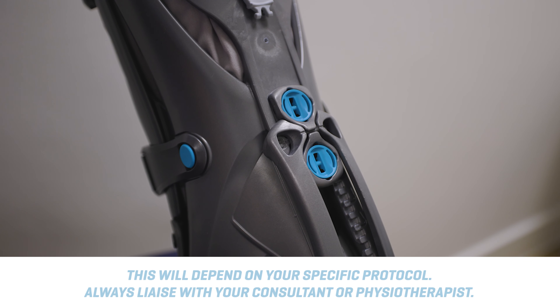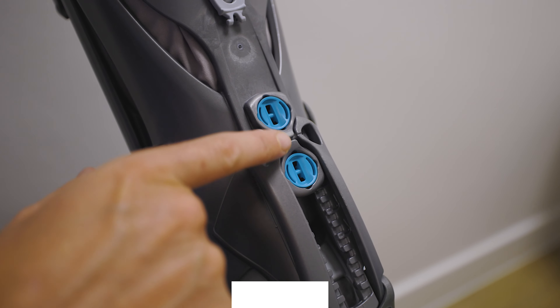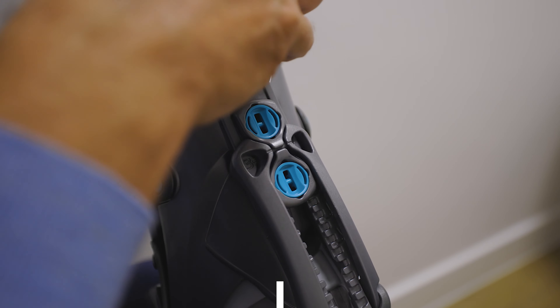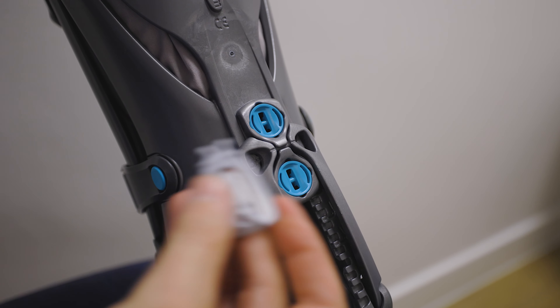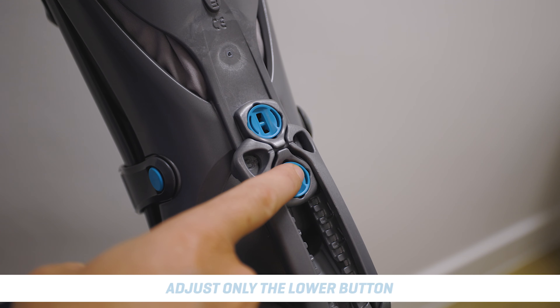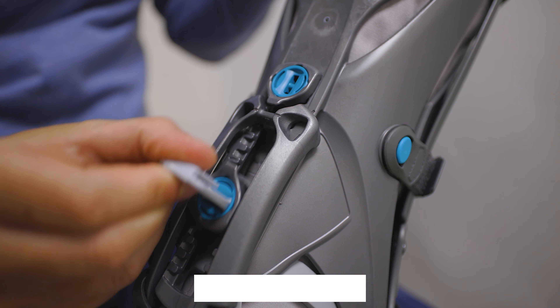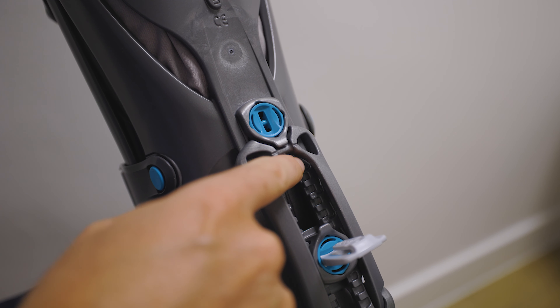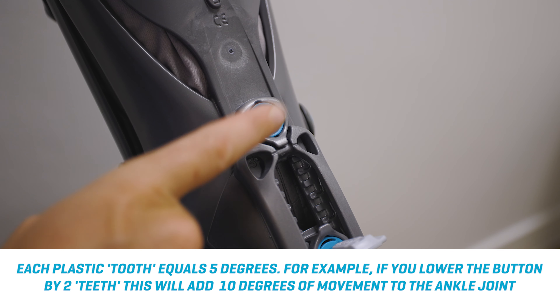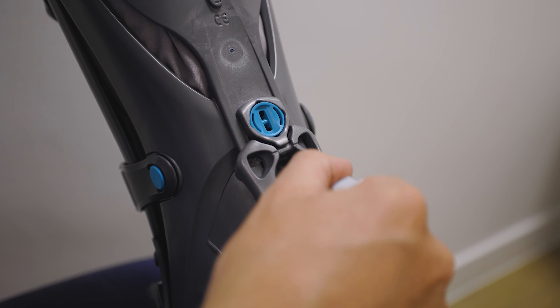After around four weeks, it's normal for your consultant or physiotherapist to ask you to change the angle of your foot. At the moment it's at 30 degrees — you can see there'll be a little three there — and both buttons are close together. To change it, take out this bit of plastic from up here, keep the top one where it is, and change the bottom button: pop it in, rotate, pull out and you can see it loosens off. You'll see these little teeth — each tooth is five degrees at the foot. Your consultant may ask you to do five degrees every half a week, or two every week; it will depend on your protocol.